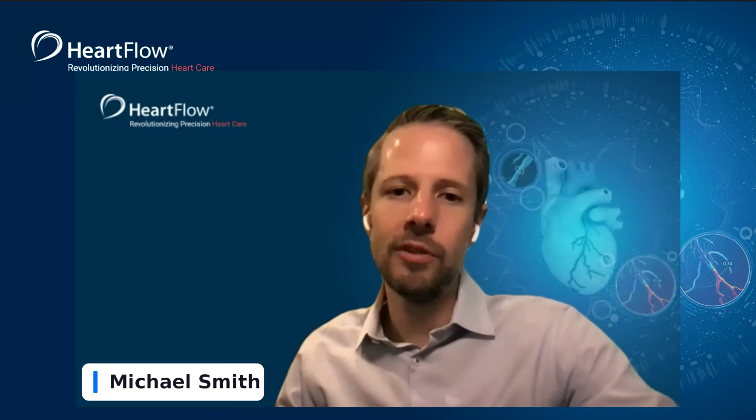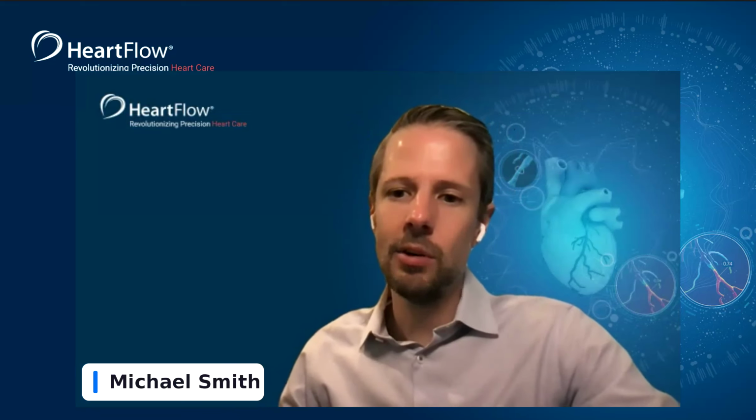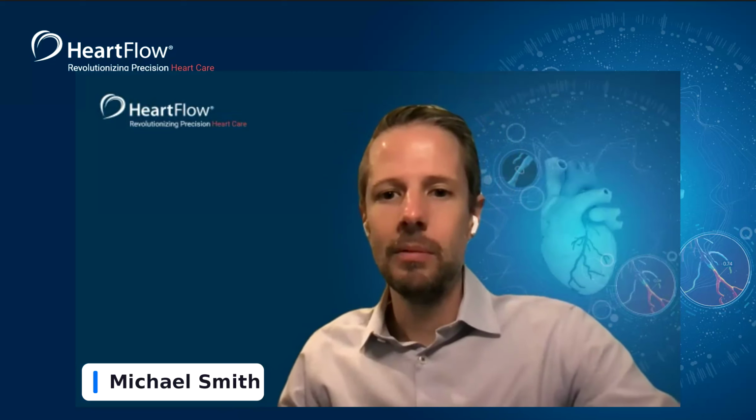Awesome. And then Stefanie, I'm sure you take this one on all the time in the field, but the range for nitro between 0.4 and 0.8, right? And some practices, some institutions sort of lean toward one, and then others go toward another. How do they think about that? And how much does that jump up to a 0.8 maybe impact what happens at HeartFlow?